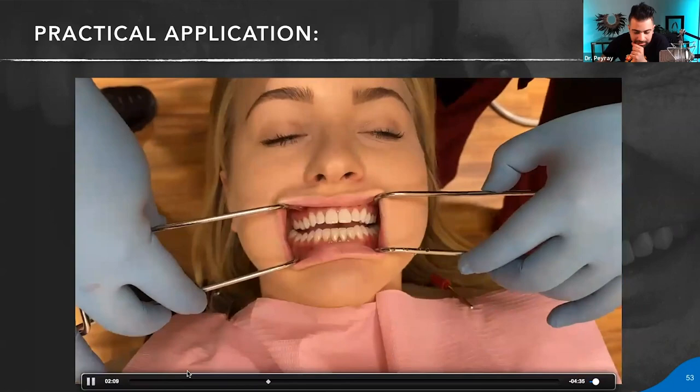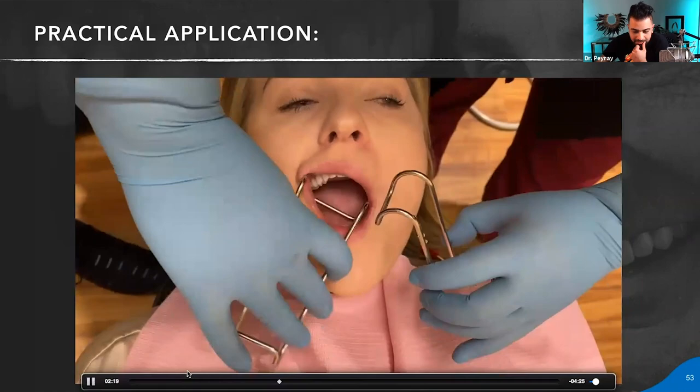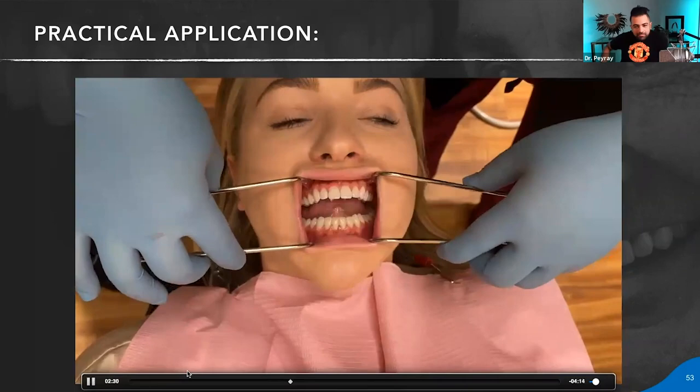Now let's try the other end and see if the other end is too big, or how it opens. Just to see. And then bigger end on that one. Open. It just kind of gives you the differences. Close. So now I can see how much you can really retract. Yeah, that's good. But you see how much more you could see.